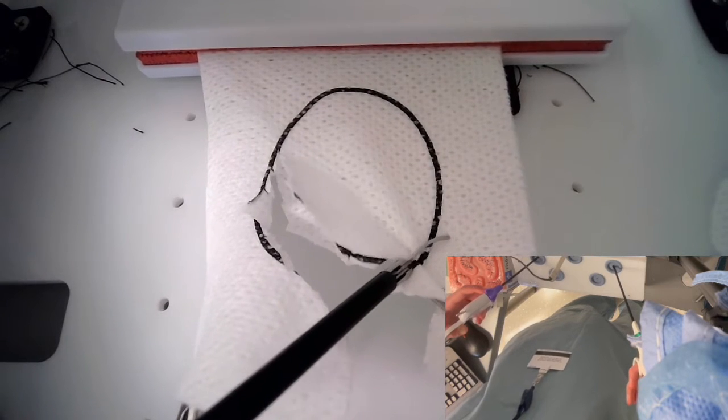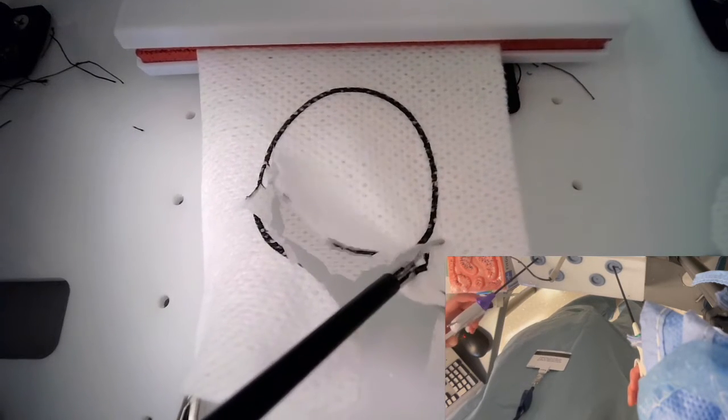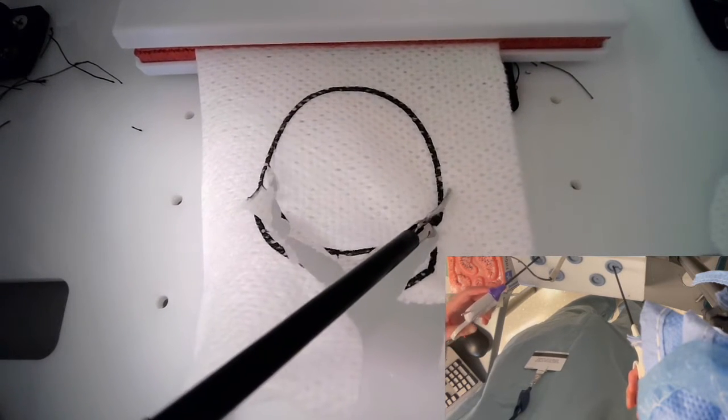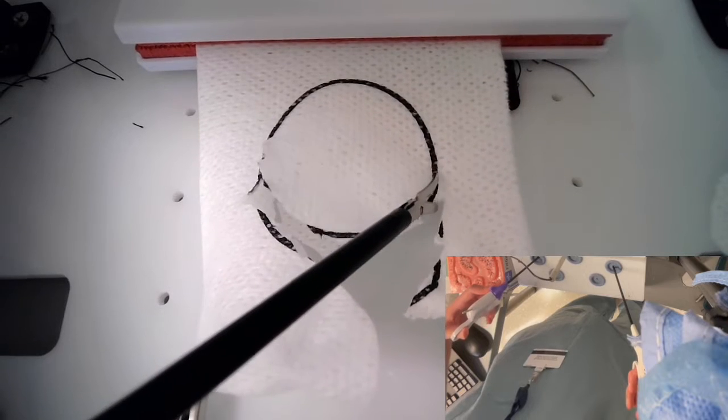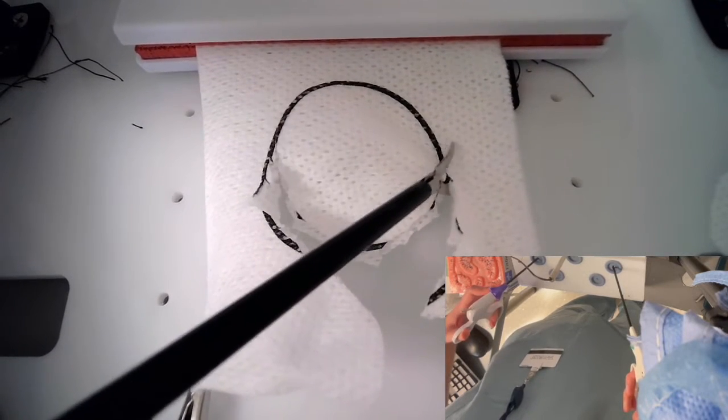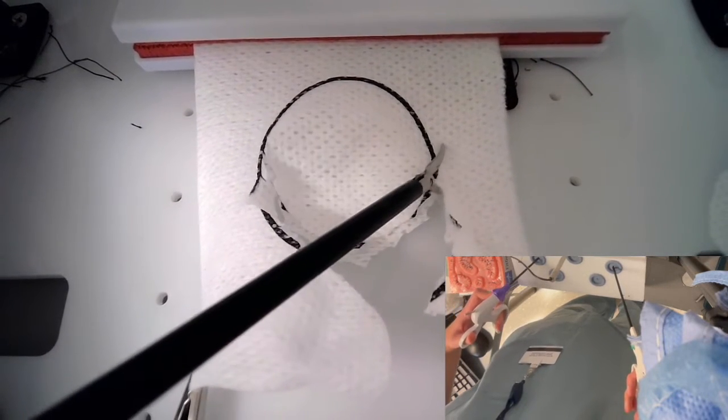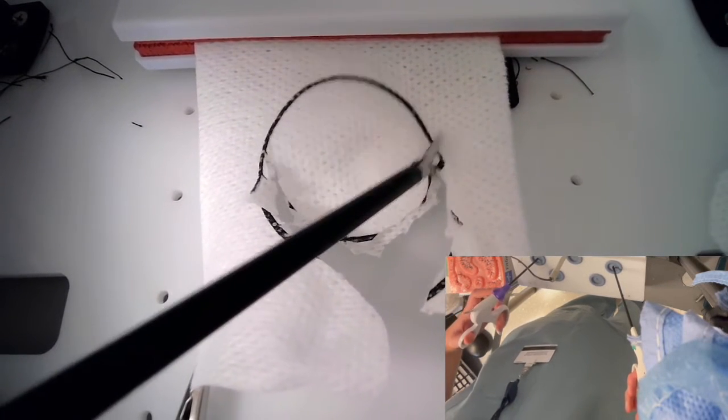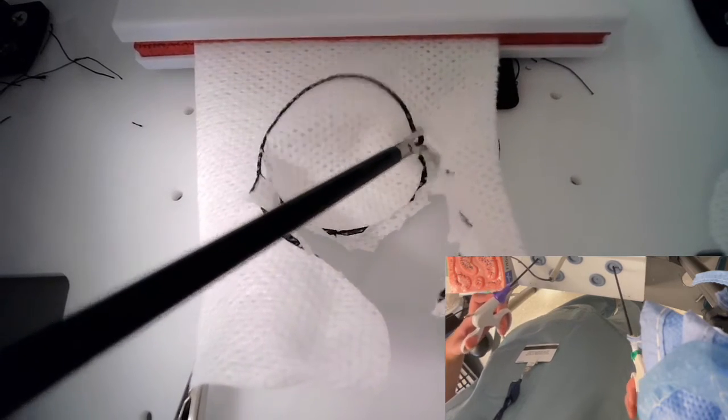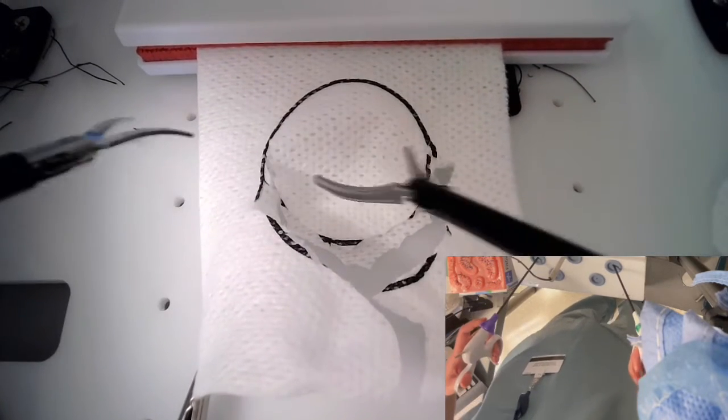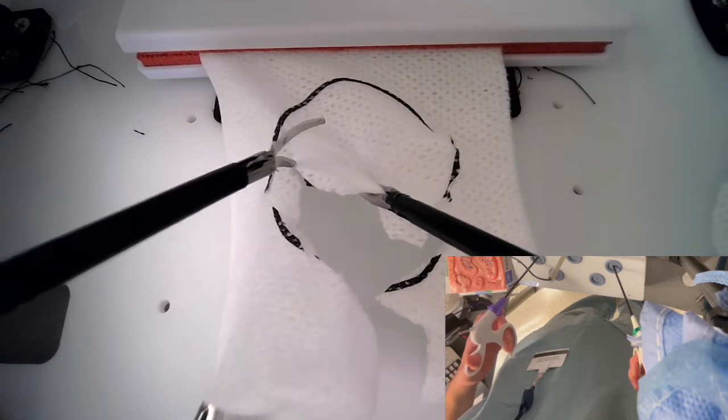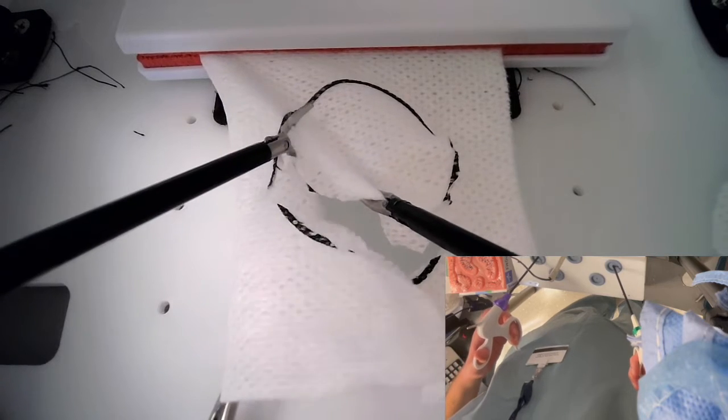Midway, you're going to switch direction of your scissor as shown, and you're going to use your left hand again to finish the top left part of the circle.